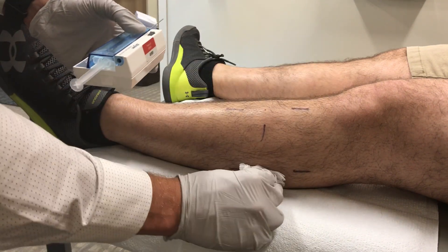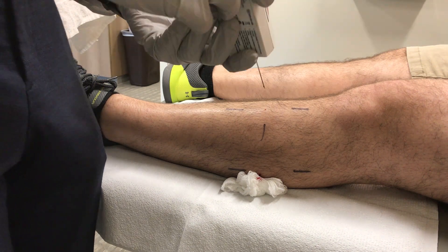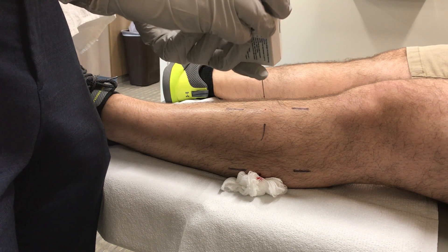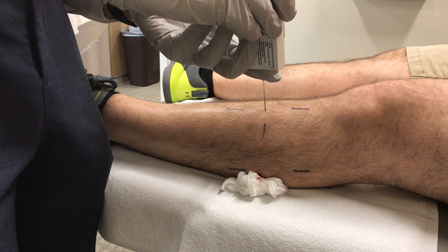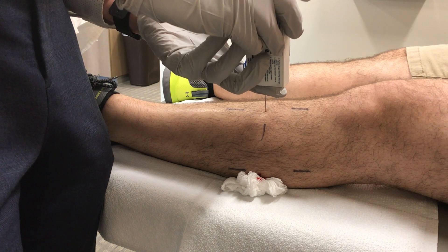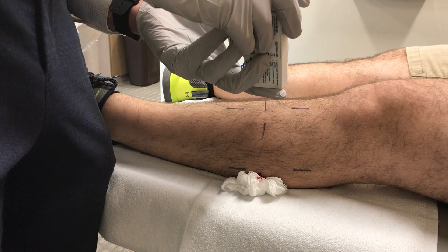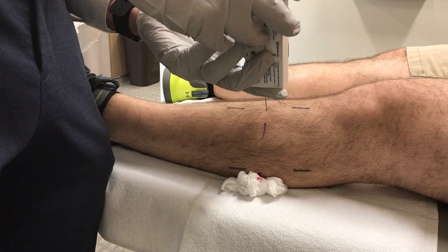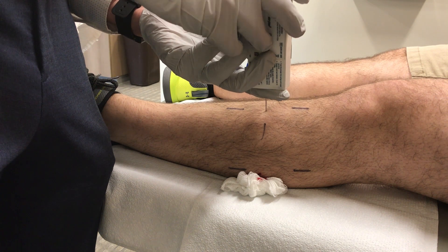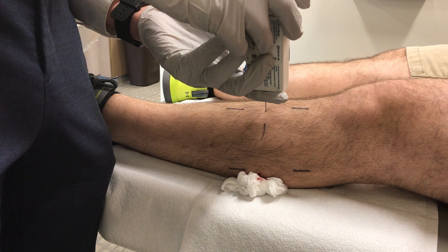There will often be a little bleeding, so I'll put a 4x4 there and wrap with an ace bandage. Now for the anterior compartment — I'm going to the lateral border of the tibia, perpendicular to the skin. I'll zero the system and go down about two to three centimeters. You can verify placement by having the patient do ankle dorsiflexion and plantar flexion — you'll see the pressure change if you're in the right area. Then inject about a quarter to a half CC of fluid and wait for it to level out.